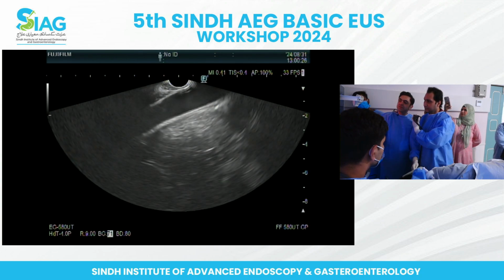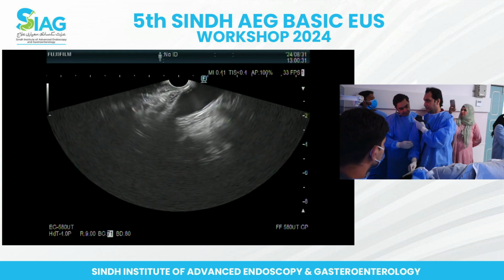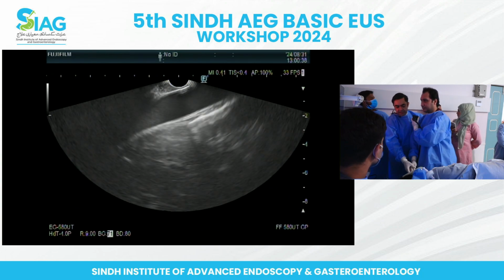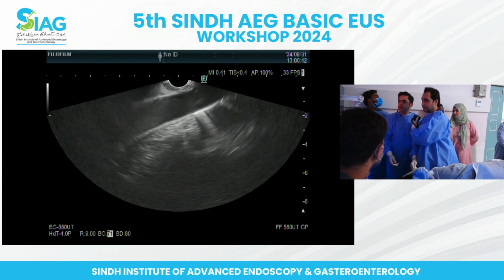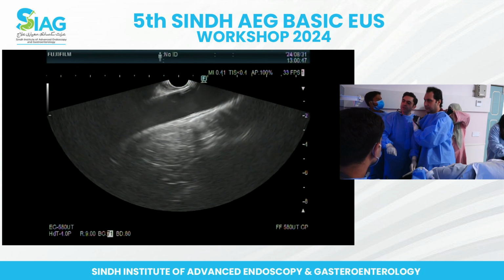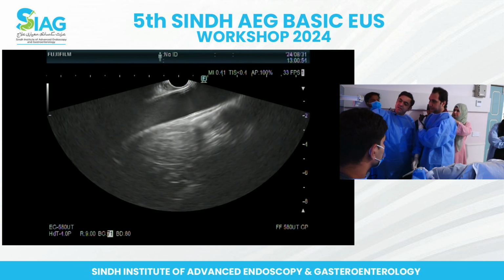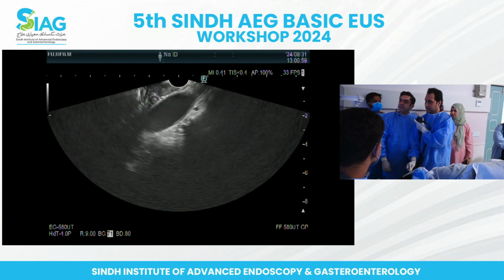Yeah, excellent. So your hand movements. You seem to be doing more of a wrist movement. Just do a bit more of a shoulder movement, and just let this rotate as well with you. Okay. And then just go back a bit. Excellent. Just to get a feel of where you are. So can you see it's becoming a bit more horizontal? See if you can make it a bit more tilted. Sometimes using the little wheel makes it like that.